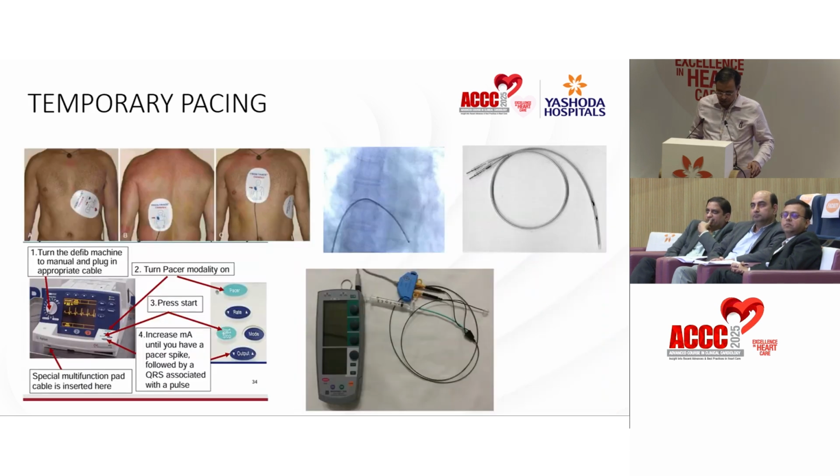Like I was talking about the transcutaneous pacing, we have these two patch positions, the anteroposterior and the anterior and anterolateral. So these are the controls. One thing that happens is when you stick on and start the pacer, it's not always necessary that it will pace or capture. You have to check the femoral pulse to make sure that it has paced. You may want to sedate the patient also because it's quite painful to the patient. So these two things we have to keep in mind.